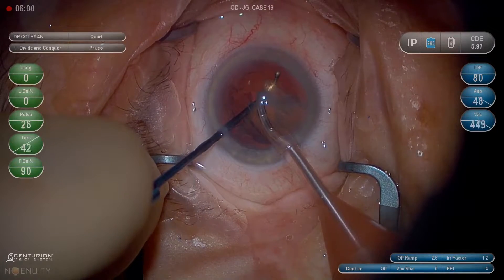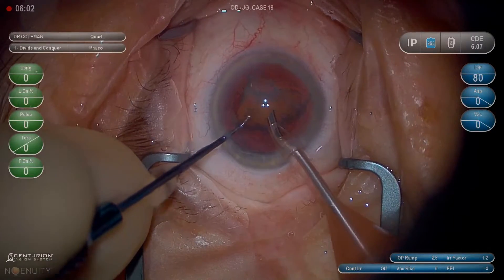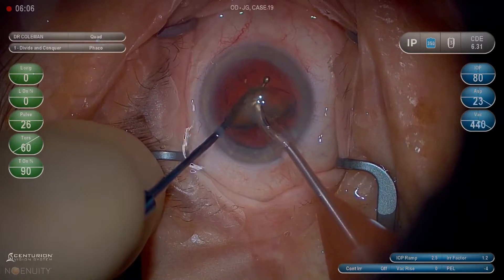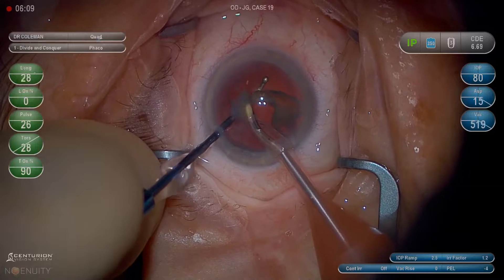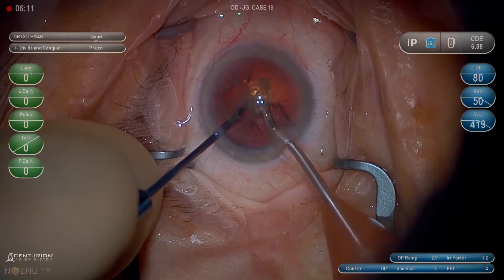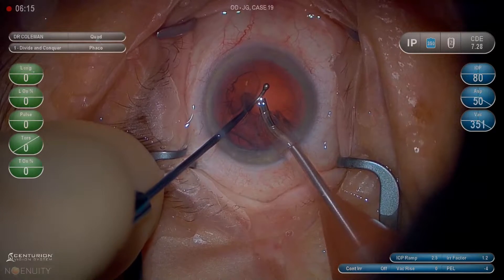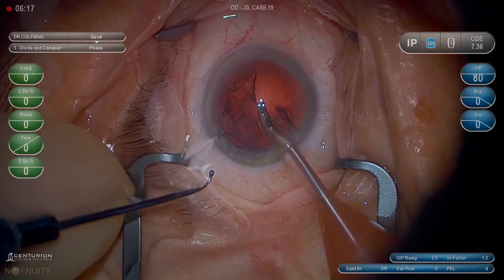Now we're being a little more careful, protecting deep with our chopper. On the last quarter we need to slow down, get the chopper deep in the center, and make sure that the posterior capsule does not come forward. The last quarter is when we need to slow down and be the most careful to prevent a posterior capsule rupture.